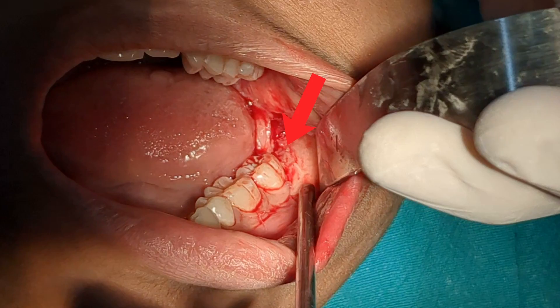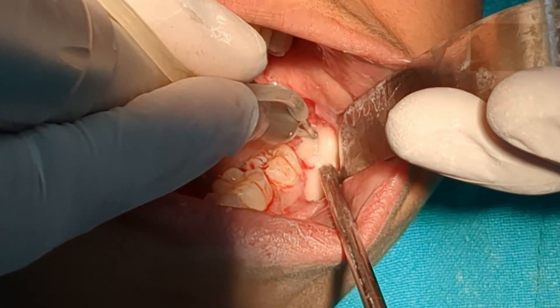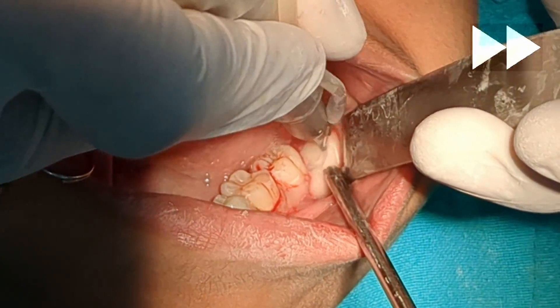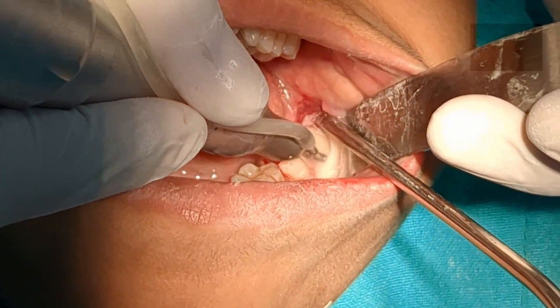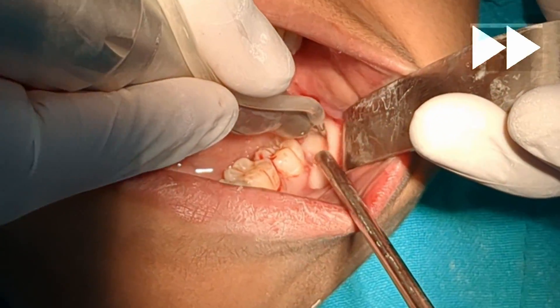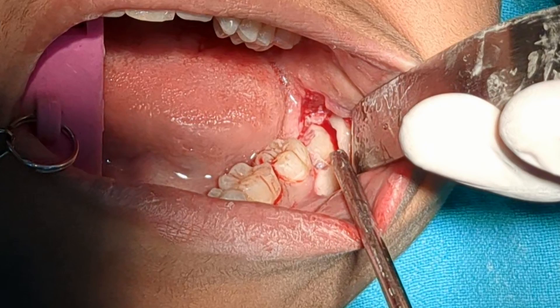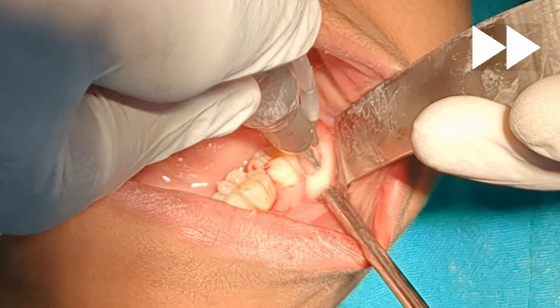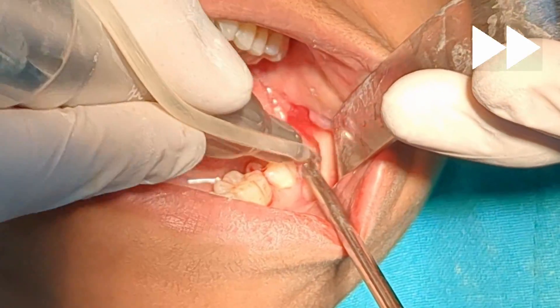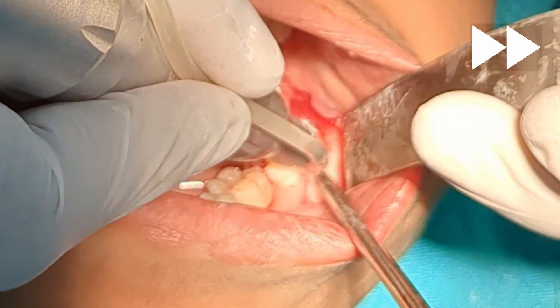You can see that only the cusps of the tooth are visible. Using an HP6 round burr, I am removing the bone adjacent to the crown of the third molar to properly visualise the tooth. We can see that the crown is now clearly visible. I then create ditches in the bone around the crown using the same round burr, and connect the ditches with a 702 straight burr to create a bone gutter around the tooth.